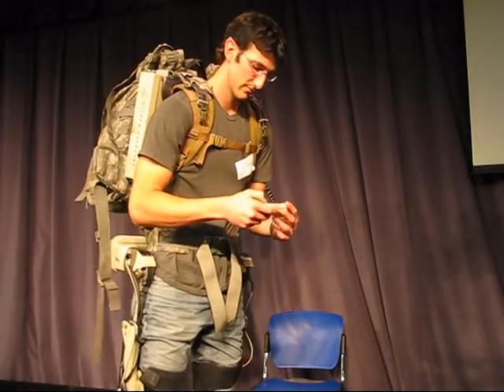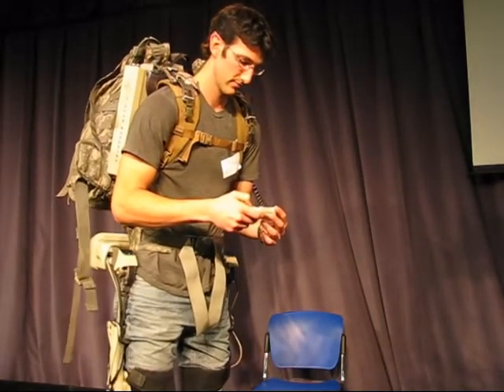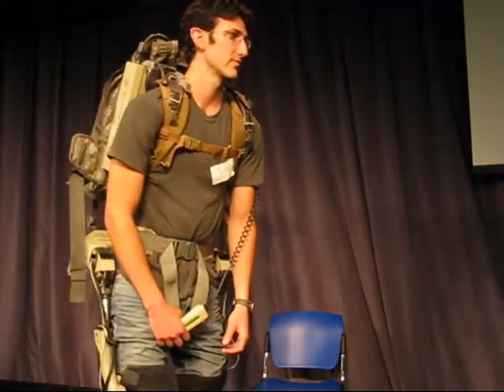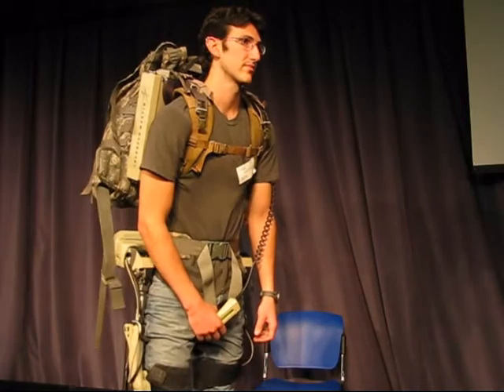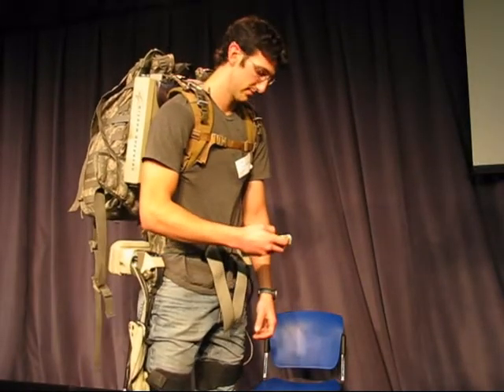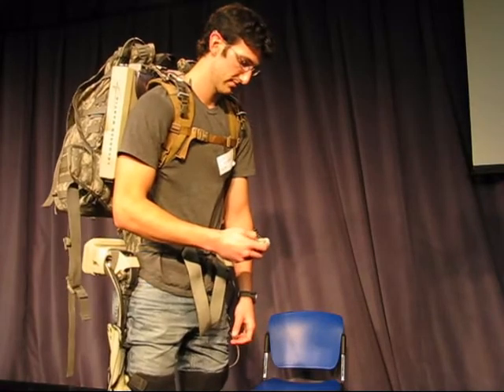shadows the user. If Sam tried to squat with no weight on and sat there in a squat, and then he actually rails the payload up to 200 pounds, it's going to try to lift him up with 200 pounds, which would be extremely uncomfortable. So you want to set that payload and have it matched to you so it follows you like a shadow.